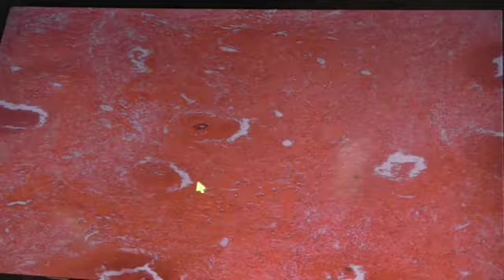All right, so if you catch it before, you're going to get reactive fibrosis, or fibrous connective tissue replacement, then you'll see something like this. If you survive for a period of time, you fill in with fibrous connective tissue, because you got loss of tissue from this site. Okay, so liquefactive can really be anywhere, bottom line. It's just going to take time for that whole thing to be resolved. Dead cells got to be removed and taken away, and then they'll create a gap in the tissue like that.